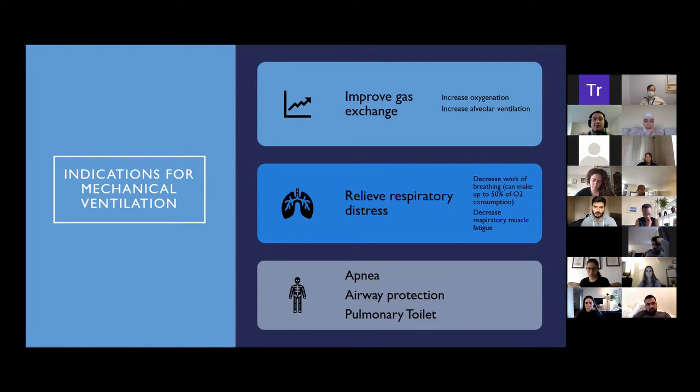In the same manner, if you have a patient that is vomiting and gushing blood, you're not going to slap a BiPAP on there, right? Because they're just going to start aspirating everything. Or if you have a patient with frank pus coming out of their airways, if you just put a BiPAP on them, it's going to dry up their secretions and start plugging their airways and causing atelectasis. So those are big no-nos for thinking about BiPAP.